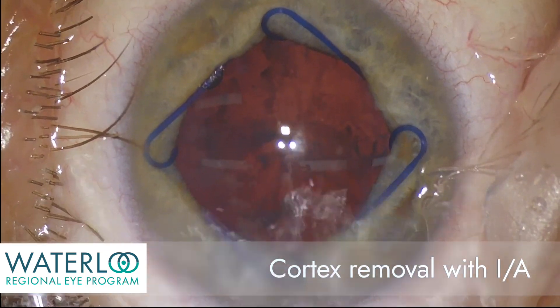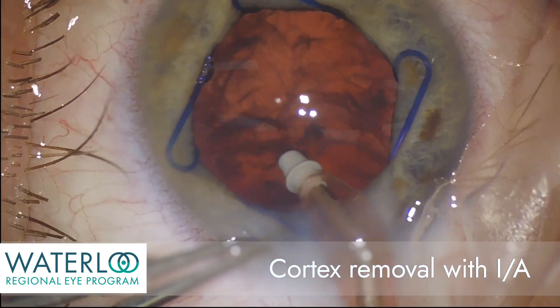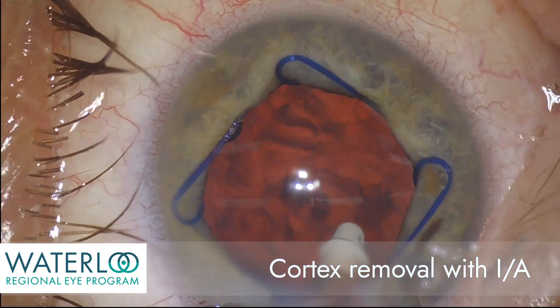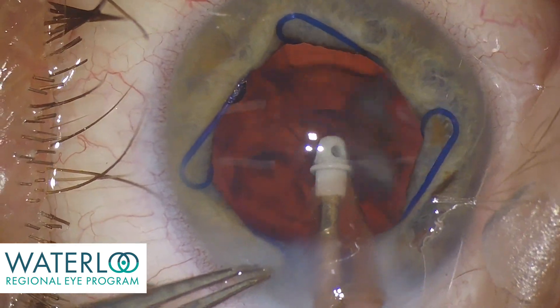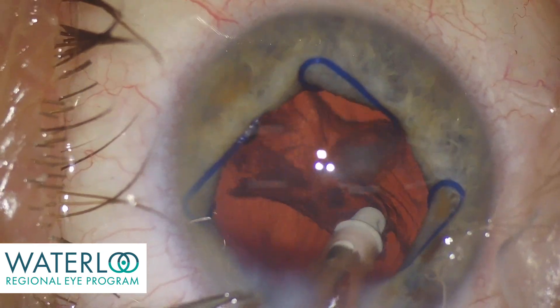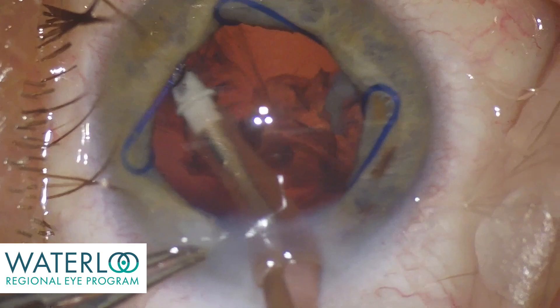Irrigation is used to maintain the eye pressure. The cortex is aspirated with a smaller handpiece that has a silicone tip and uses specialized irrigation fluid. The cortex is the outer coat of the cataract, and once it has been removed, we can then prepare to insert the new implant.